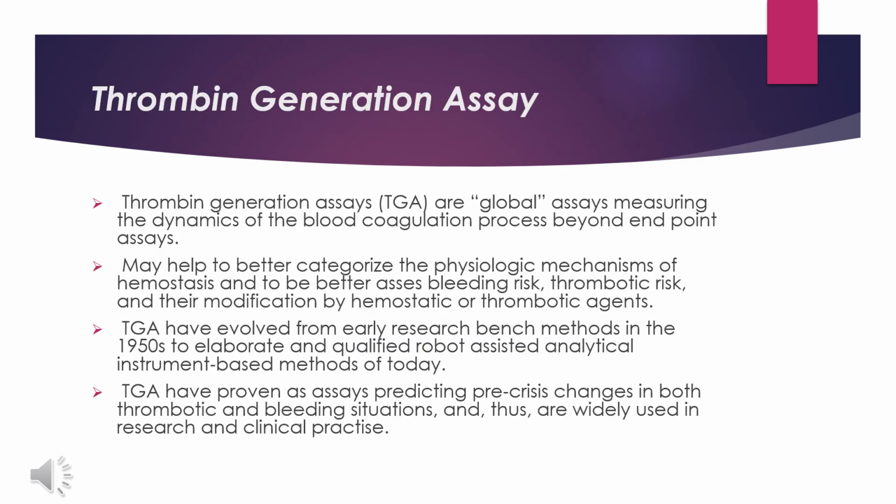Thrombin generation assay. Thrombin generation assays are global assays measuring the dynamics of blood coagulation process beyond endpoint assays. It helps to better categorize the physiologic mechanism of hemostasis and to better assess bleeding risk, thrombotic risk, and their modification by hemostatic or thrombotic agents.